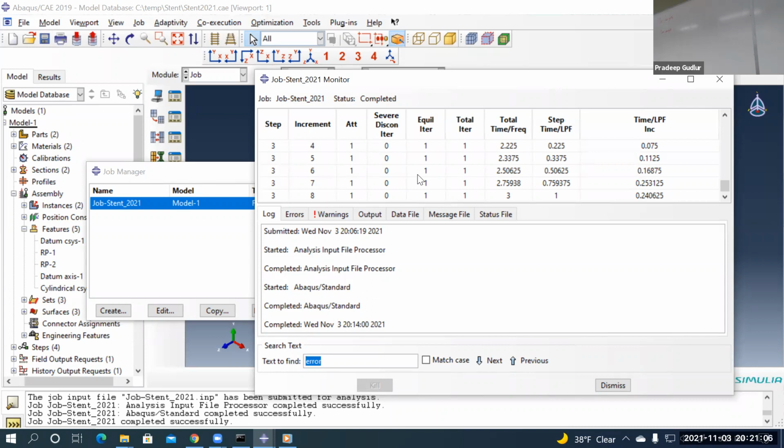And you should have this running, otherwise you will see only a static image. It's pretty good. And it's holding the pressure step. So when it goes to step 3, it's retaining it. So slow it down so someone can actually observe all this. In step 3, it's retaining the shape. Should I slow it down? Yeah, slow it down. You know how to do that? Yeah.